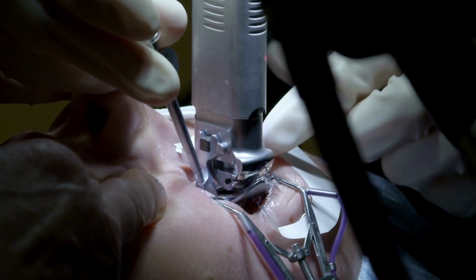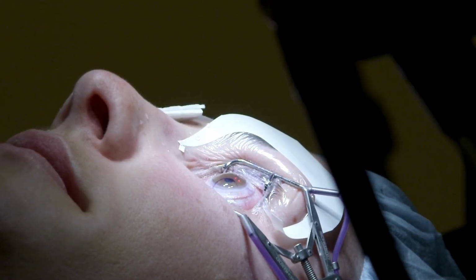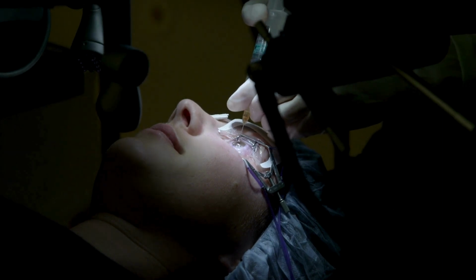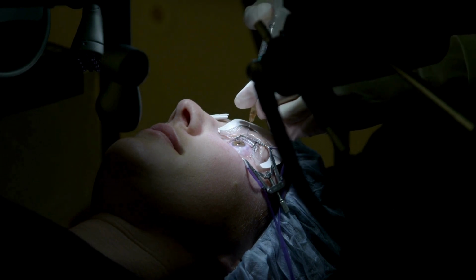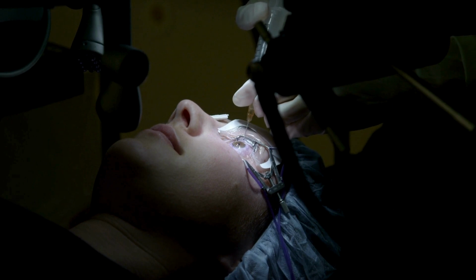Early identification and monitoring of ectatic corneal disorders. Early keratoconus is not detectable by slit lamp examination. Because of this, corneal topography and tomography have become standard for screening keratoconus suspects. In cases with established keratoconus, tomography-based corneal topography plays a role in monitoring progression.